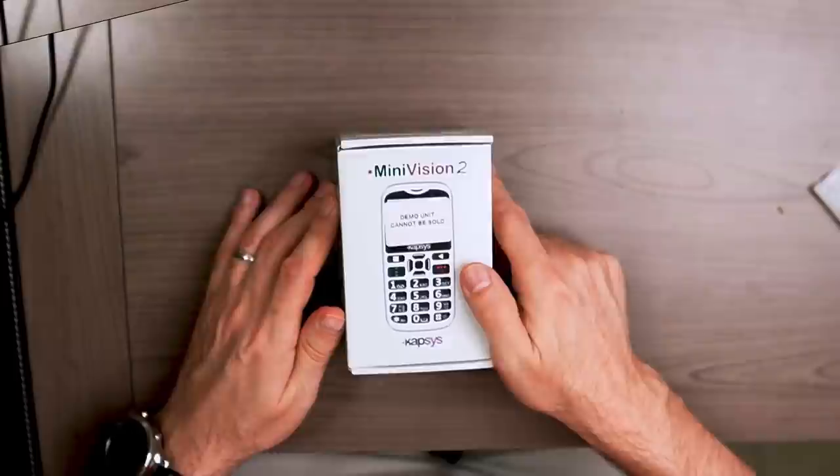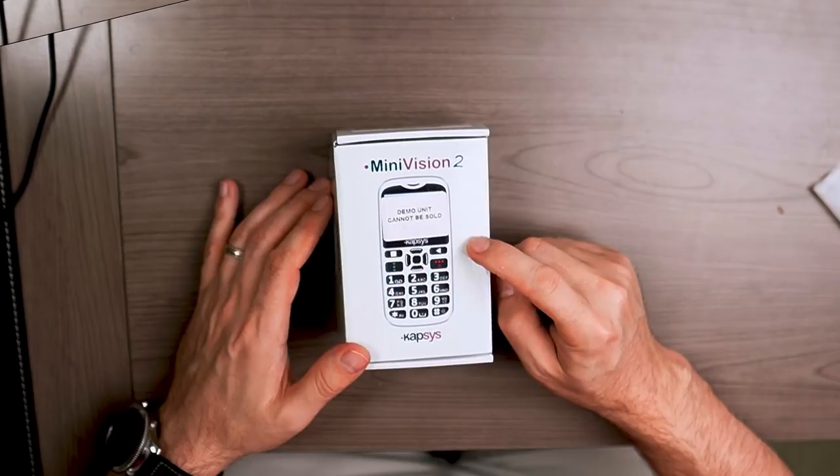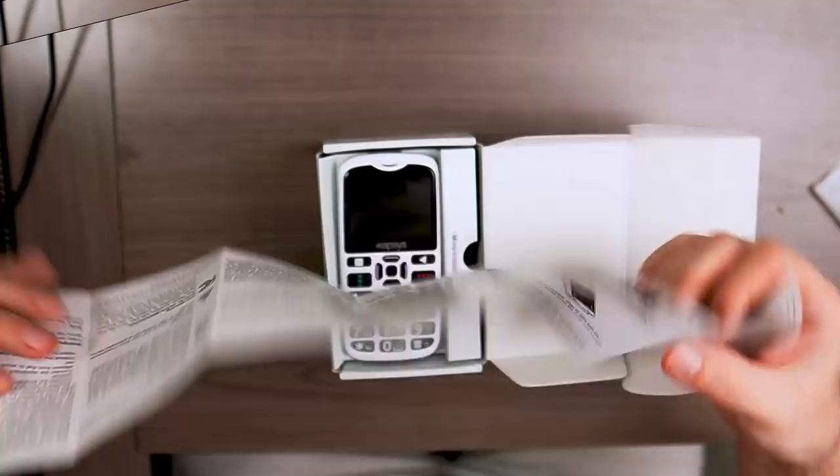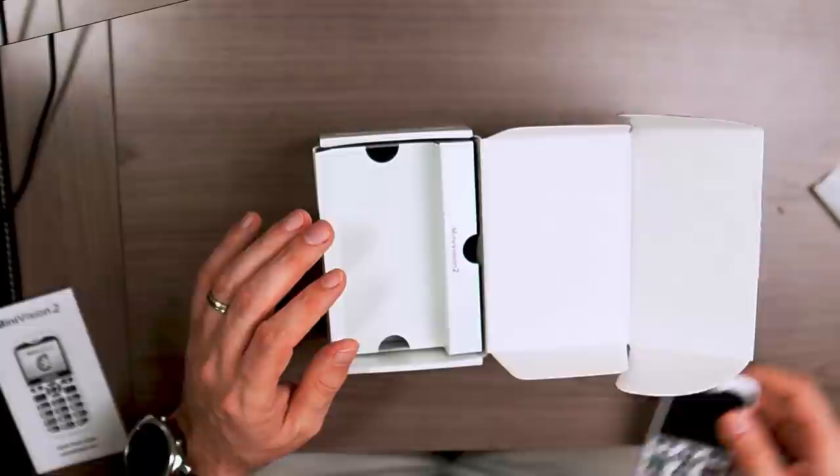The packaging has a very minimalistic design, nothing flashy. You've got a drawing image of the Mini Vision 2 on the top of the box. Inside, we have a manual — a quick start guide for the phone, probably warranty information. Then you have the phone on the top.